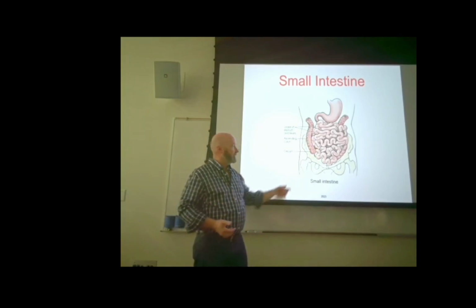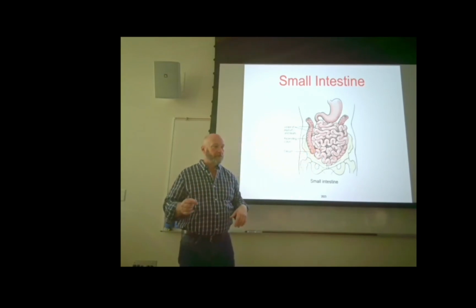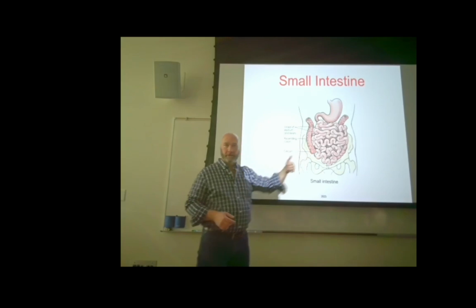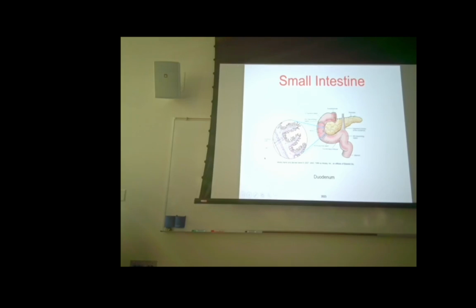And that is your telltale sign that you've made it to the junction between the small intestine and the large intestine. That's what we refer to as the ileocecal valve. It's where the ileum, the distal portion of the small intestine, meets the colon. So when you're doing a small bowel series, we want to see spillage over into the large intestine, and possibly use fluoro and get some spot images of that ileocecal valve, if at all possible. So the villi look like that. Again, the duodenum, ligament of Treitz, pancreas, the head of the pancreas, that's right in that C of the duodenum.